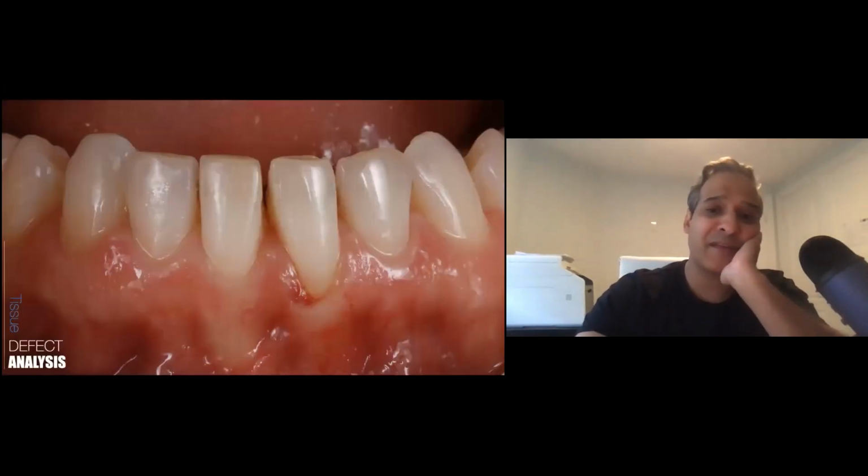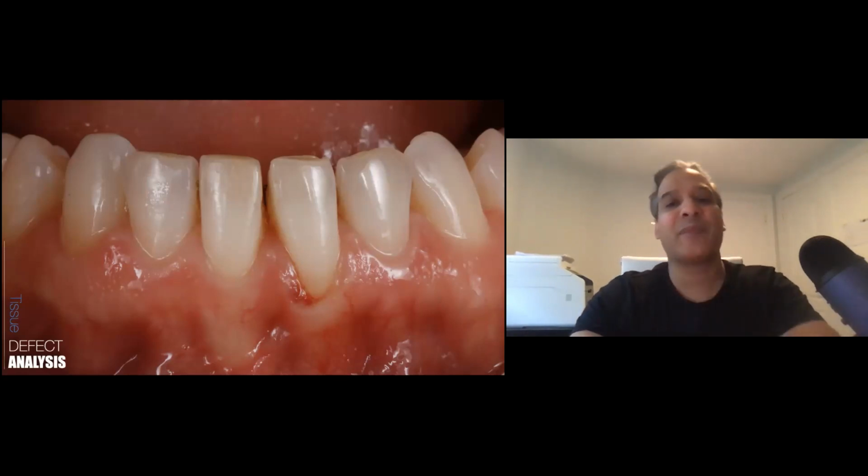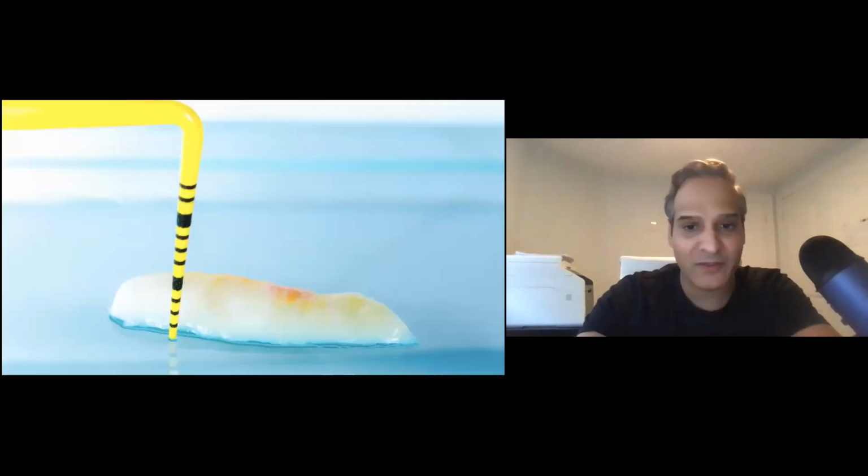Another case, same thing, thin tissue. You can see a light frenal pull. The recession is because it's created a ledge. The tooth is sort of tilted buccally. It's creating a plaque trap. You can see the mild inflammation there. You get a nice thick connective tissue graft.